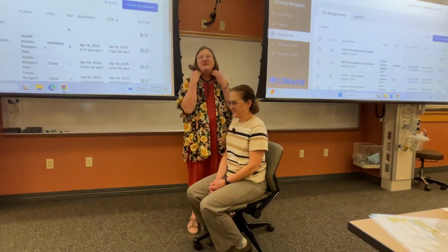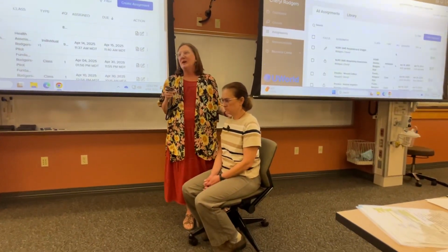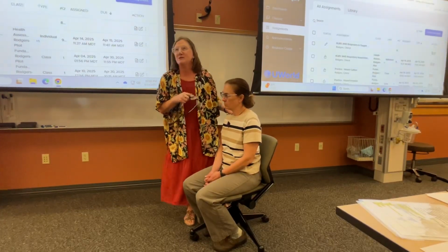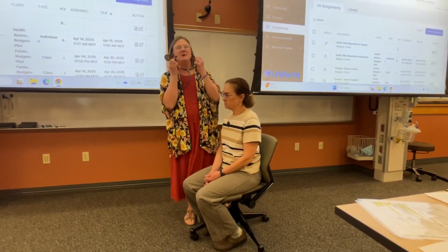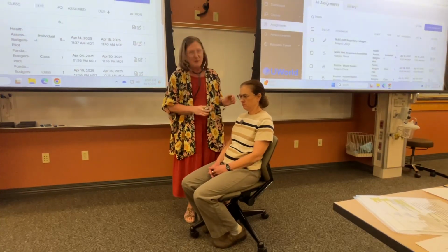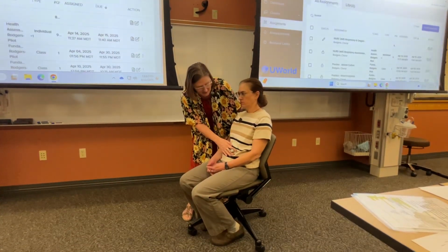Good. Now, if this is my patient that's lying in a hospital bed, I'm going to tell them that I'm going to go ahead and listen to their belly before I have them start moving around or anything, okay? So I'm going to come down here, Mel, and I'm just going to listen to your belly real quick, okay? And so Mel is lying down in the bed, and I'm going to listen in all 4 quadrants.